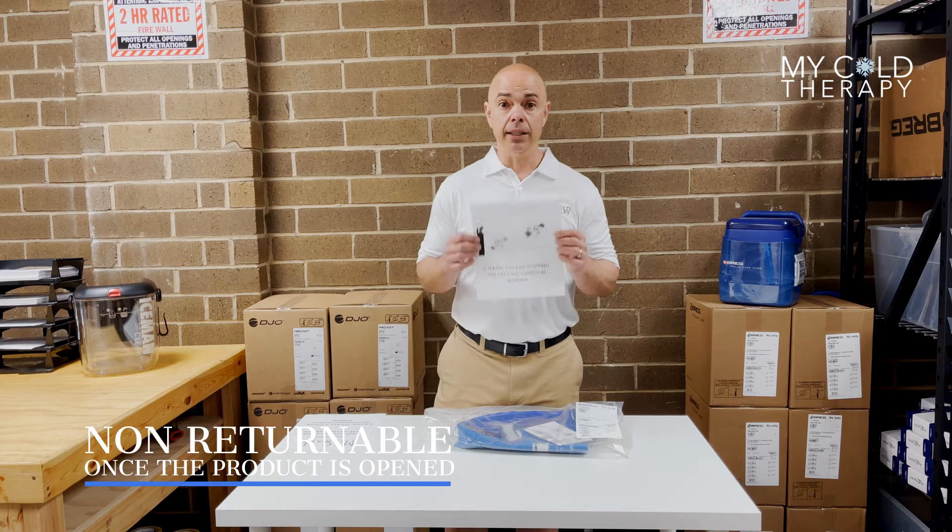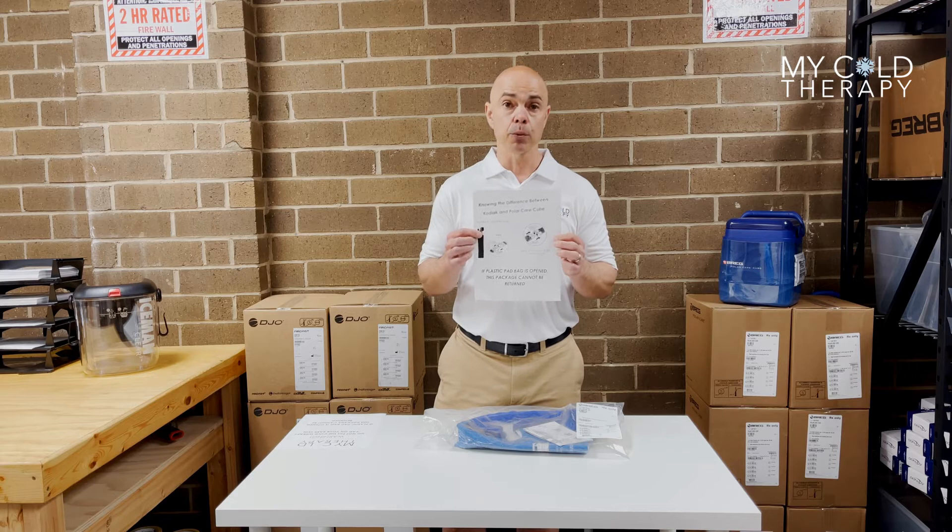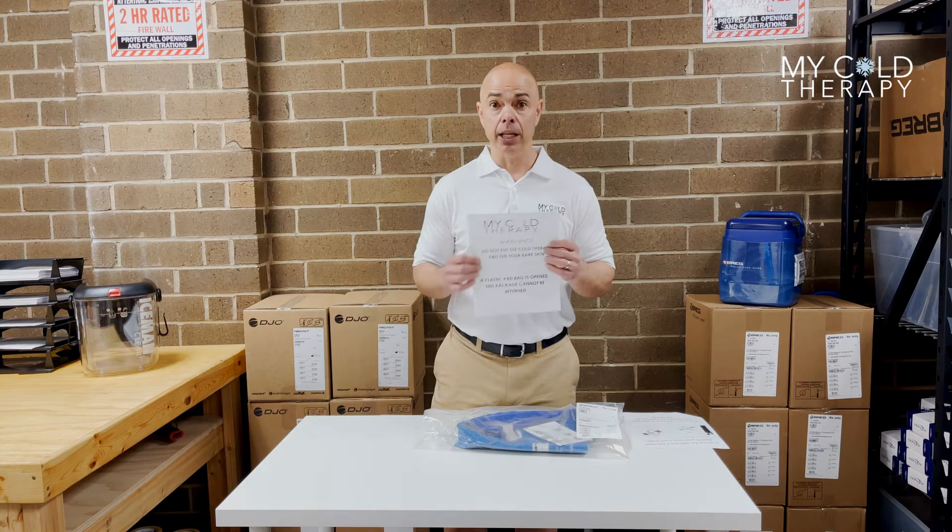Inside the bag, you're going to get this little pamphlet that says Cube and Kodiak. It's going to show you the connector, so please make sure you have the correct connector. Also inside the bag, you're going to get the skin warning label that says please do not put this on your bare skin — you could cause injury.